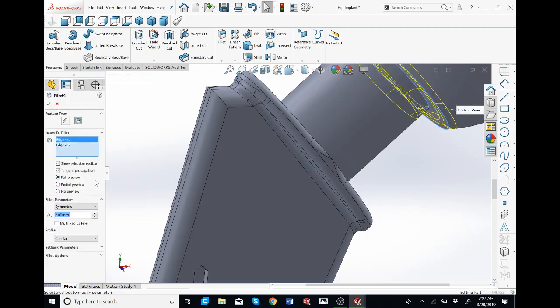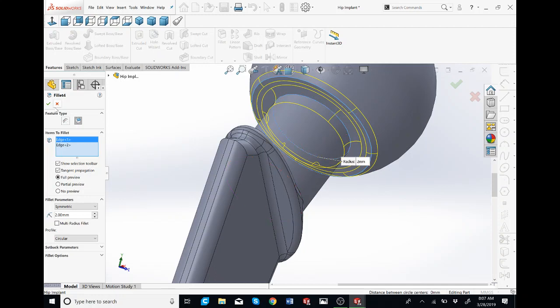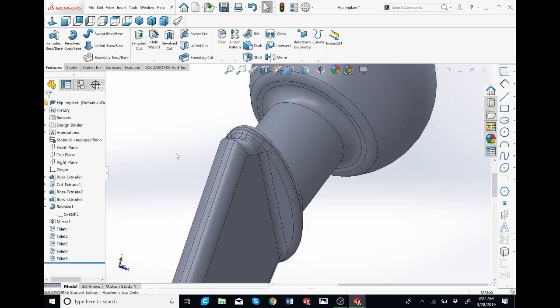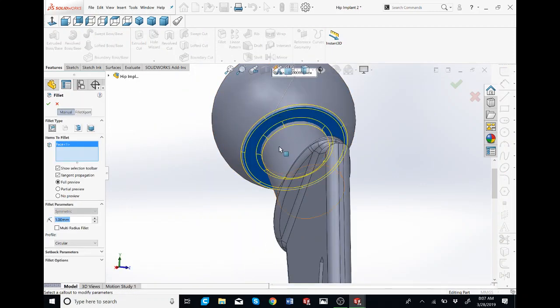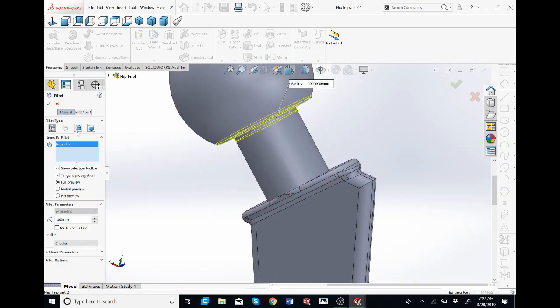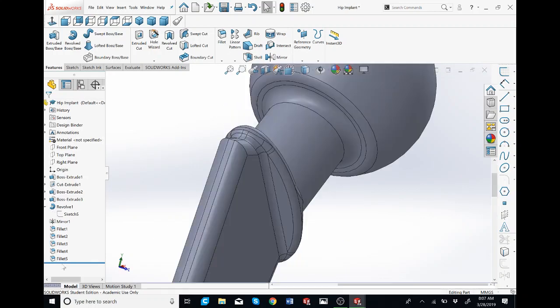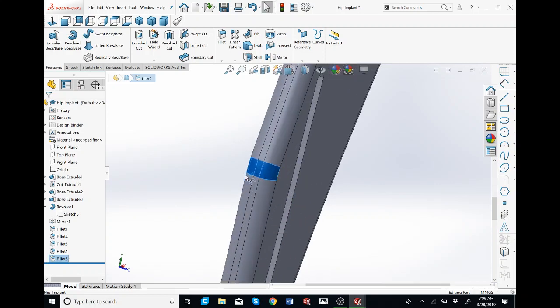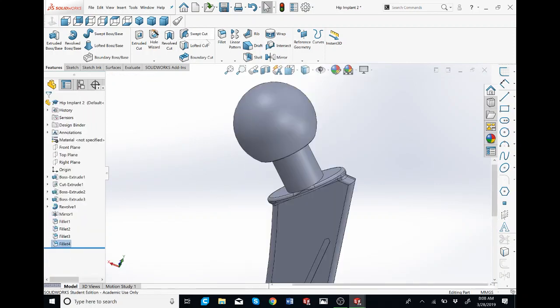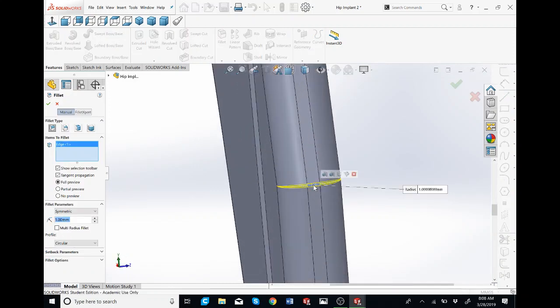Do this, add a feature, 2 millimeters on that one, on these 2 edges. Fillet. And I just click on this. Yeah, I can just click on the face or the 2 edges. Select the same thing, hit check. And I have 1 more fillet to go. Just over here. And this one's 10. So fillet. I'm going to zoom in just so it's easier to select. Click on this and make this 10. Check.